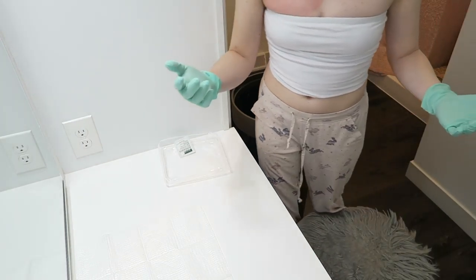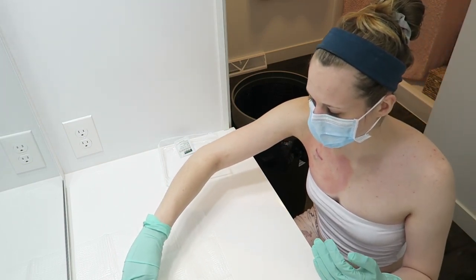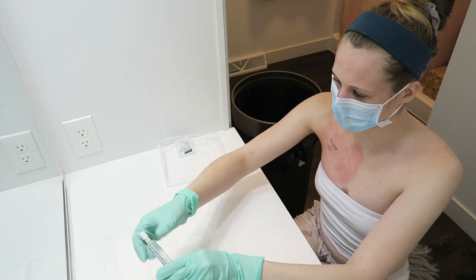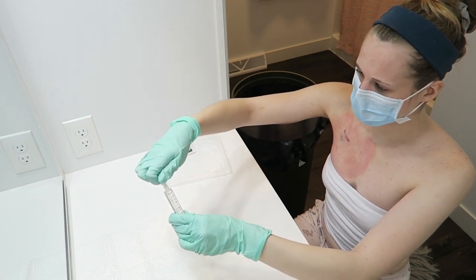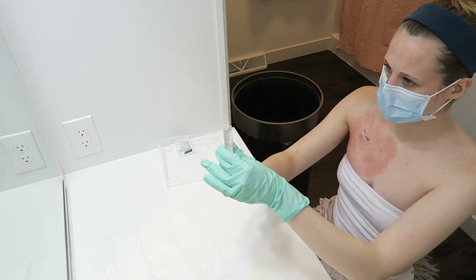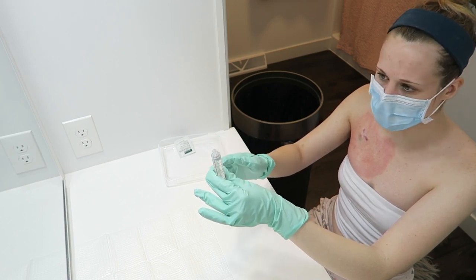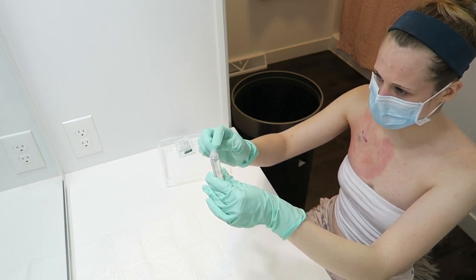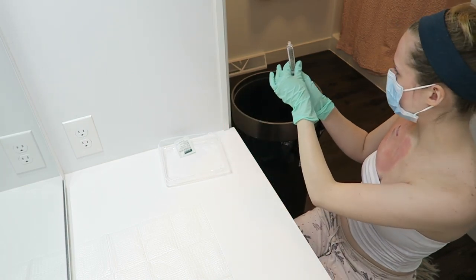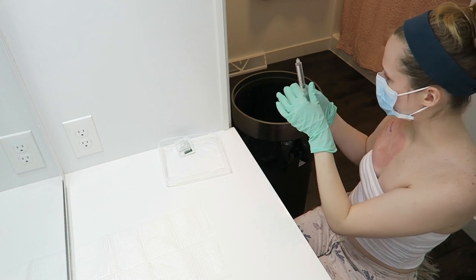And we're going to go ahead and prime our needle. What that means is basically we're just going to put saline through it. I can touch all of these objects now because I am sterile. So I'm going to go ahead and open my syringe. And I'm going to pull back. Normally I do not prep my syringes like this. I just haven't found a way to prep my sterile syringes the way I do my other ones. But I'm going to go ahead and over the floor, kind of get the saline out.